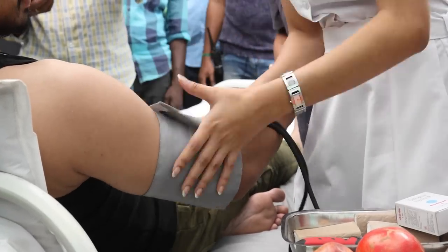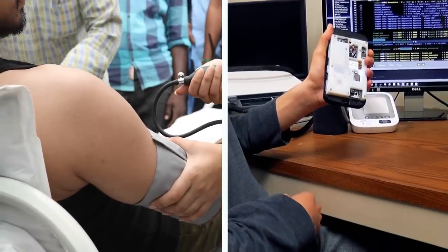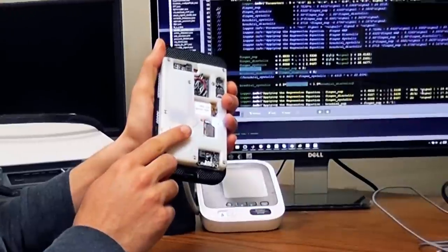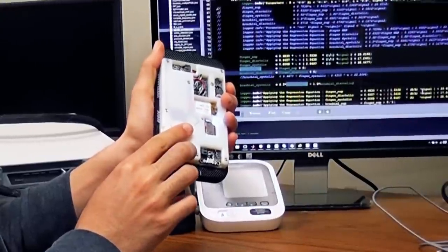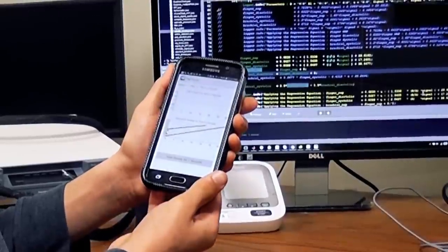This new device uses the same principle as the conventional arm cuff, but instead of a cuff varying the external pressure on the artery in your arm, the user varies the external pressure by steadily pressing their finger against a special case attached to a smartphone.